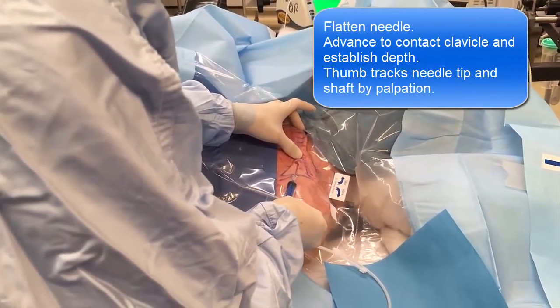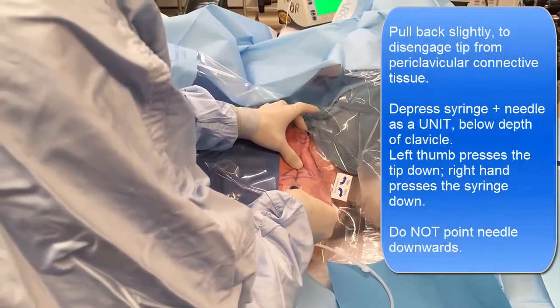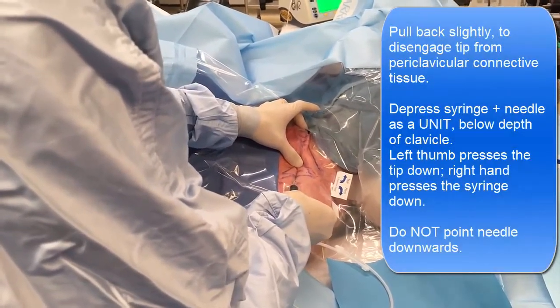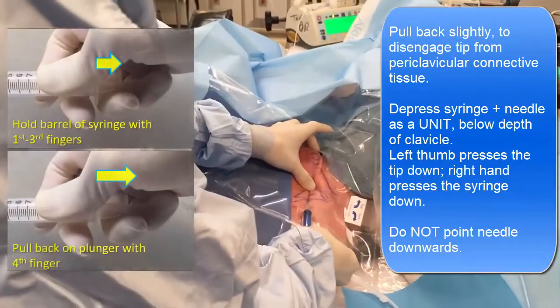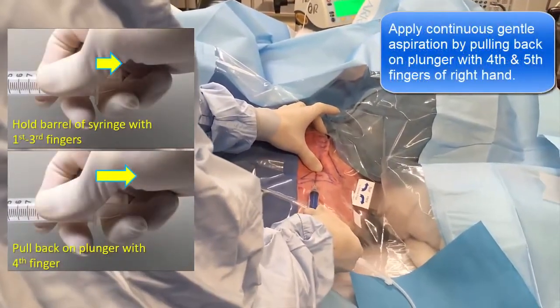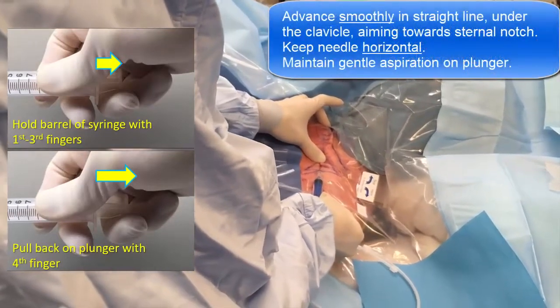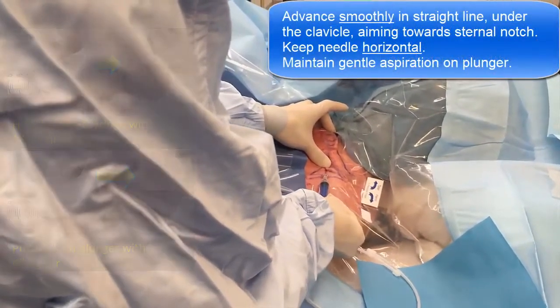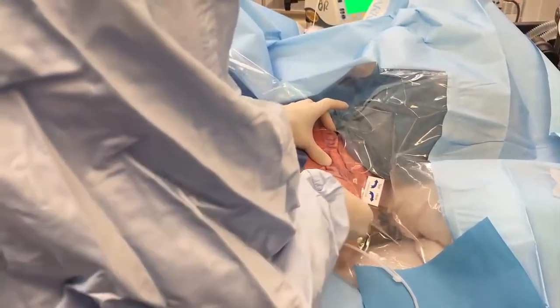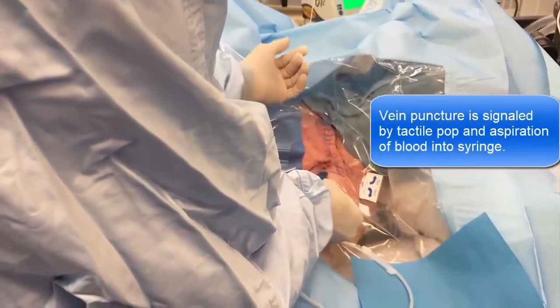So I know what the depth of the clavicle is. Now I push back, and I push this down so I'm pushing the tip of the needle down. I'm pulling back on the syringe with this hand, and then I'm just advancing under the clavicle in a straight line towards that sternal notch.